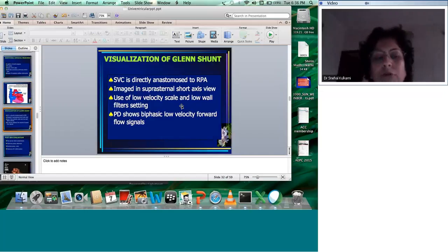Now you do a Glenn, and then we have to do an echo evaluation post Glenn, because you may land up in a situation in the ICU with a patient with a Glenn who is swollen up, or who is significantly desaturating, and you will have to tell them the reason.